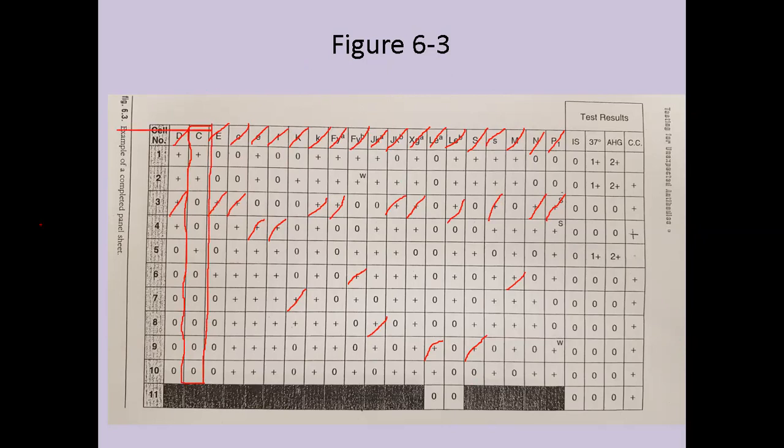All right, so we've eliminated everything we can, and so we really only have one specificity left, C. And so what we want to do is look at our patterns of reactivity and see if they match when the antigen is present on the cells and when it's not. So when we look at cell 1, C antigen is present and we see that patient reacted.